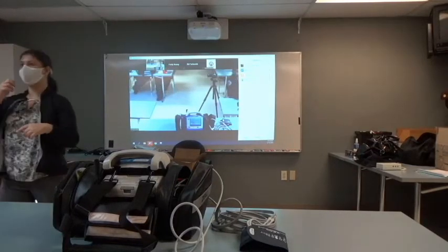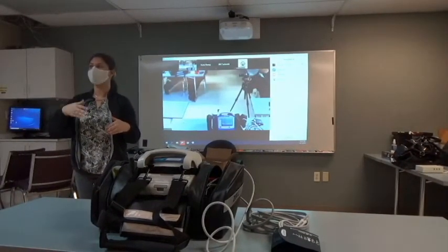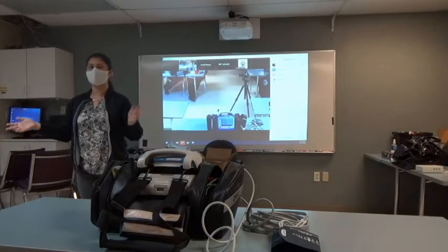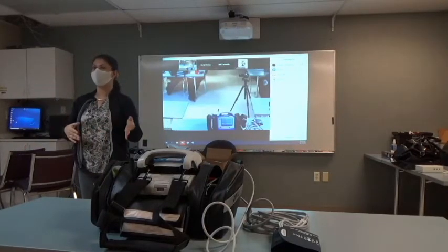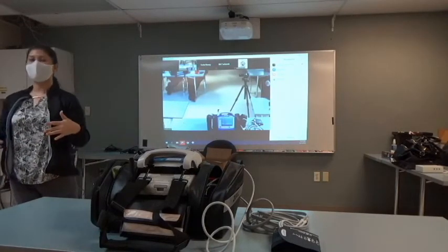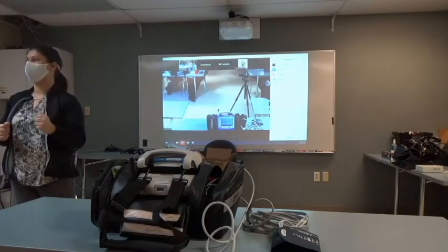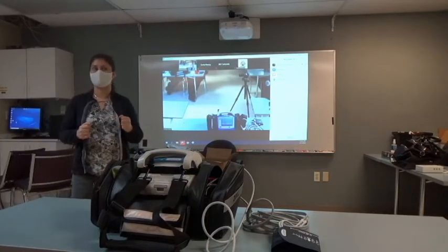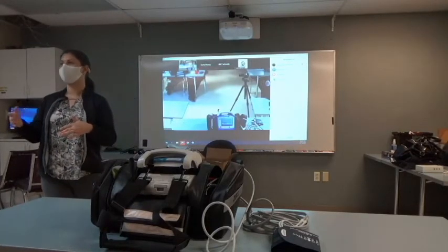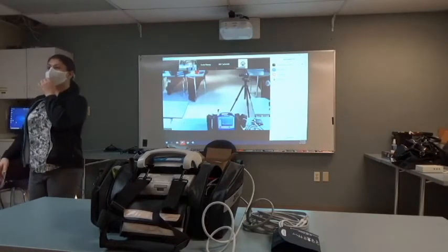Very good. Okay, so as the energy's traveling through the body, it's got to hit bone tissue, muscle mass, adipose, all that good junk, right? So it is way smarter than me. It customizes the energy in the background for each patient so that it takes into account what that resistance or chest wall impedance may be. And it will deliver that energy so that you give the actual 200 that you asked for, taking into consideration that resistance. So it'll document both. It's really for QA, QI purposes. You're gonna document the 200 or whatever joule settings you gave. Everybody okay? All right, let's walk through disarming the device.